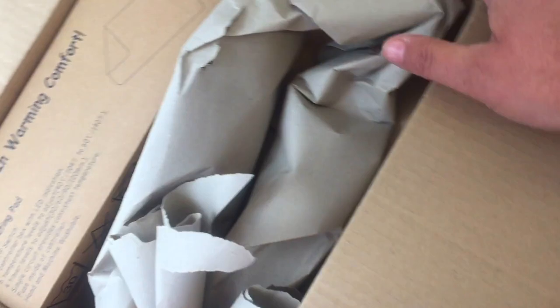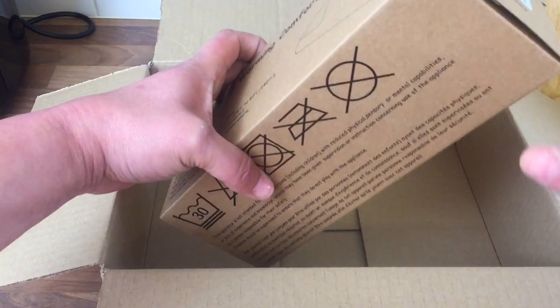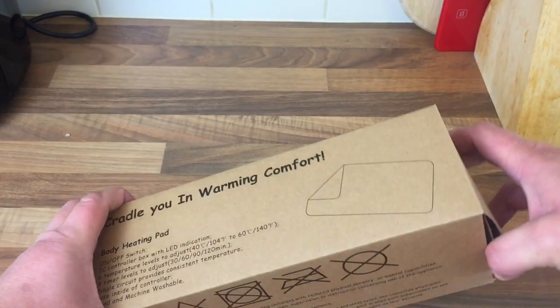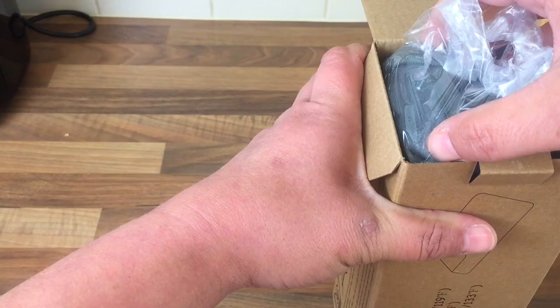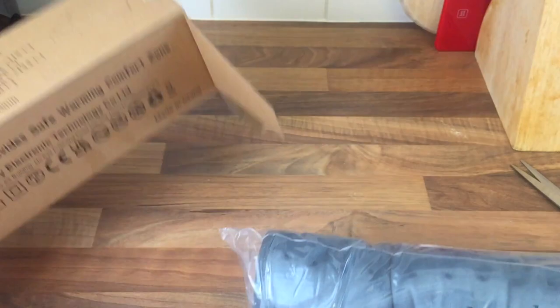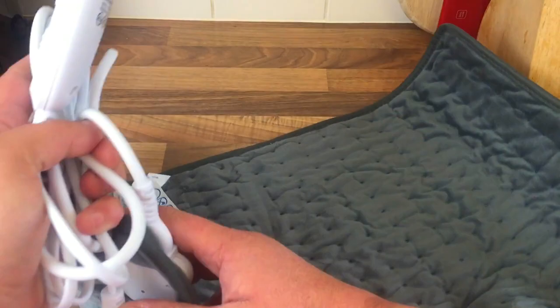It's nicely and securely packed. There's nothing in the piece of paper, so it's the box that we want. Like I said, this was £15 off Amazon and I ordered it yesterday and it came today.